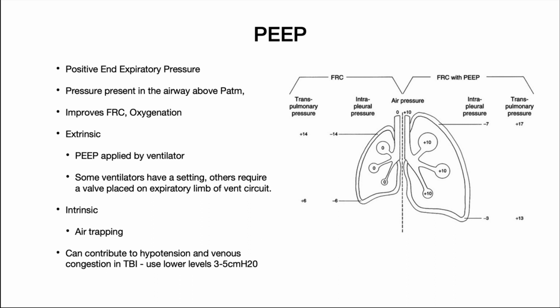Applying PEEP increases alveolar pressure and alveolar volume. The increased lung volume increases the surface area by reopening and stabilizing collapsed or unstable alveoli. PEEP therapy can be effective when used in patients with a diffuse lung disease with a decrease in FRC. PEEP and IPPV both contribute to a rise in intrathoracic pressure, and this can contribute to hypotension after placing a patient onto a ventilator.